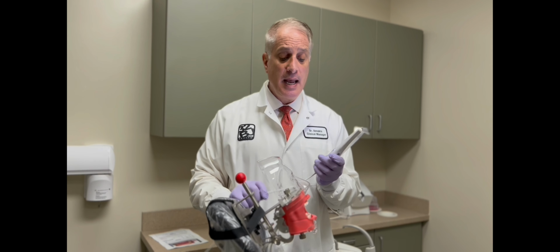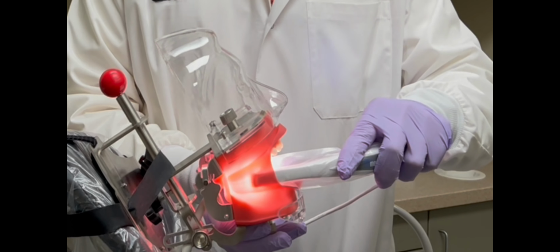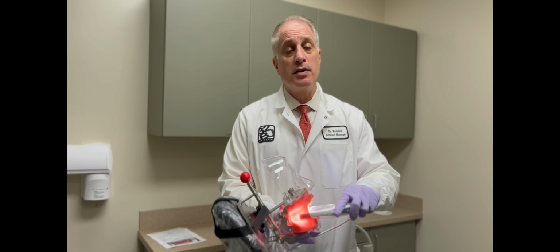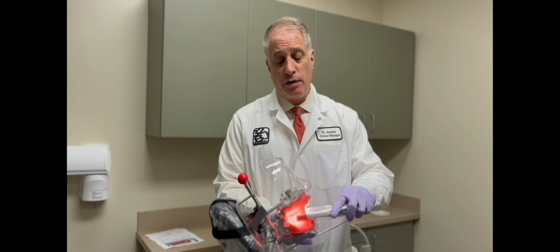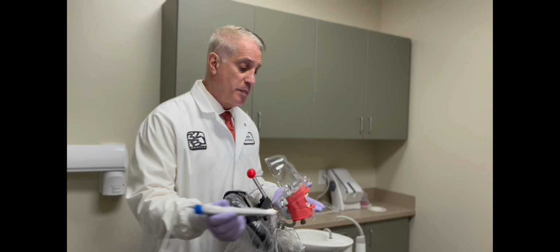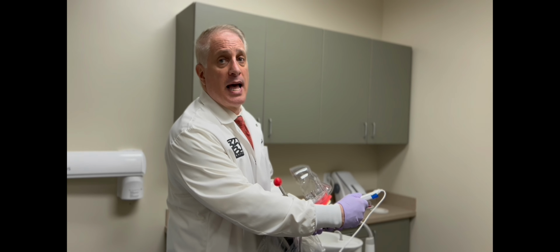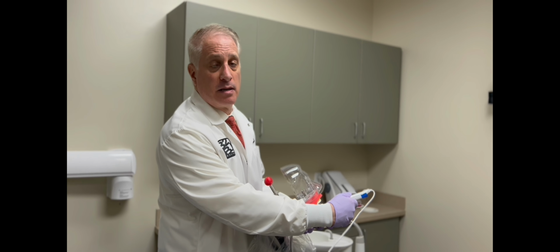Another example is the retract cheek method. I retract the cheek to take pictures of the buccal surfaces of the teeth that I'm taking a picture of. Finally, there's the 12 o'clock technique or position, where I insert the camera intraorally gently this way, and I'm able to take a picture of the palatal tissues.